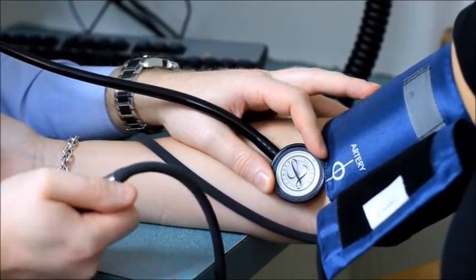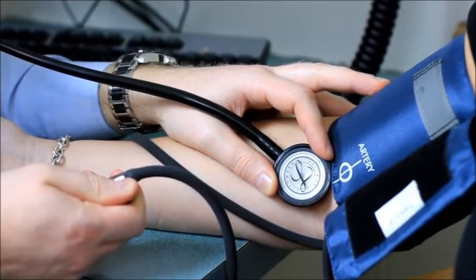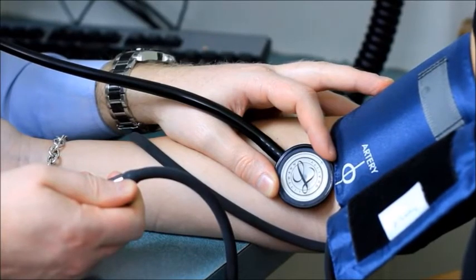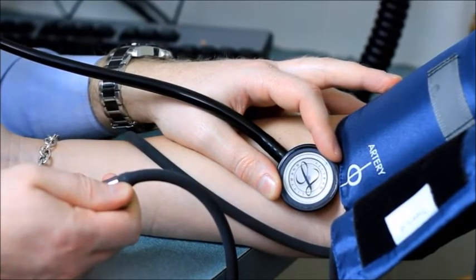The blood pressure should be measured at least twice, waiting one minute between readings, then recording the average of the two measurements. In the following example, please listen for the various phases of the Korotkoff sounds while you observe the reading on the manometer.